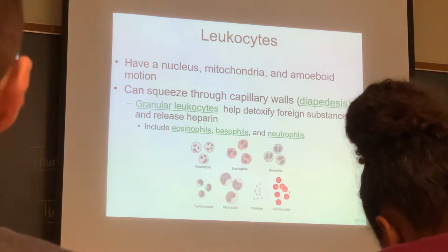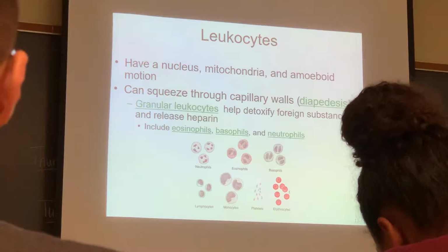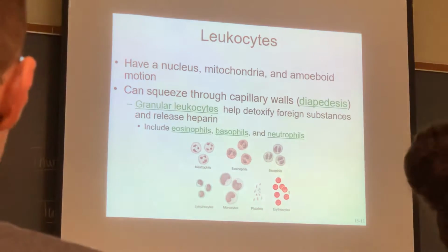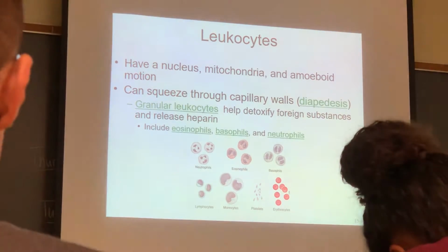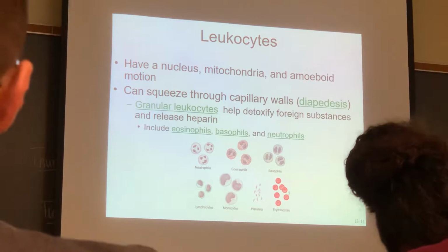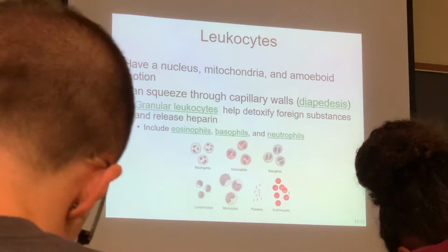Neutrophils contain granules that favor both acidic and basic dyes. They stay pink in color. They're polymorphonuclear. They're the first cells on the front line in an acute infection, and that infection is usually bacterial. Most abundant cell type in the blood.